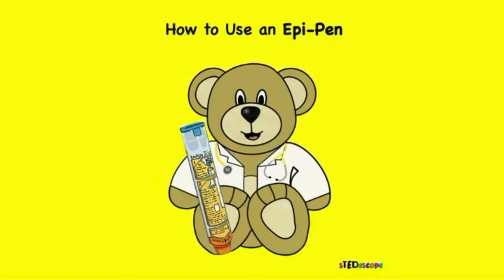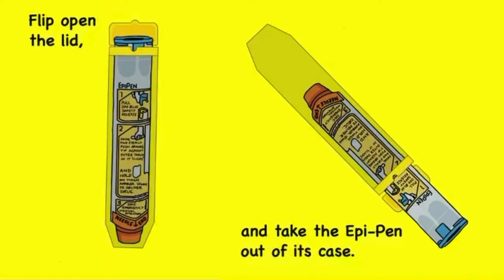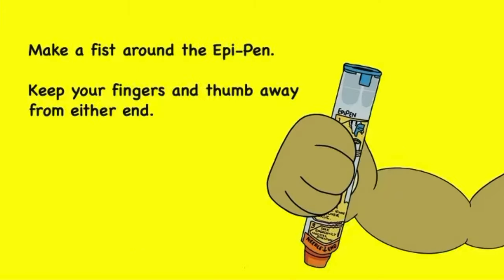How to use an EpiPen. Flip open the lid and take the EpiPen out of its case. Make a fist around the EpiPen, keeping your fingers and thumb away from either end.